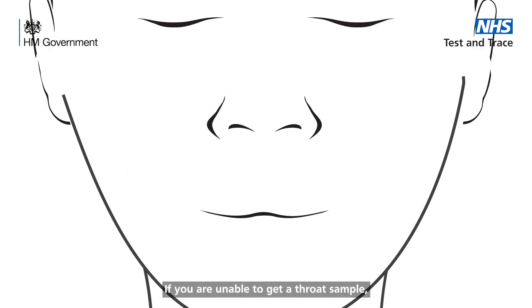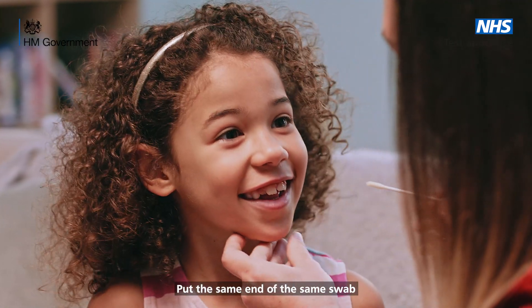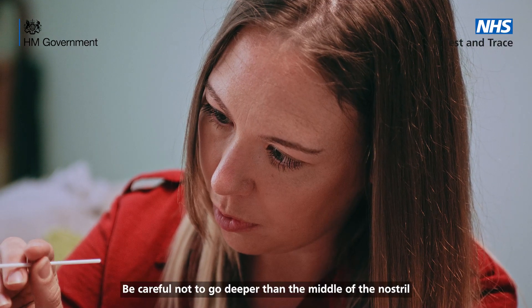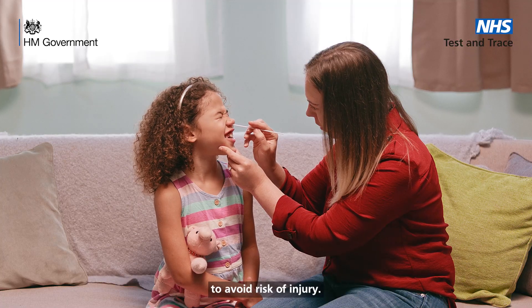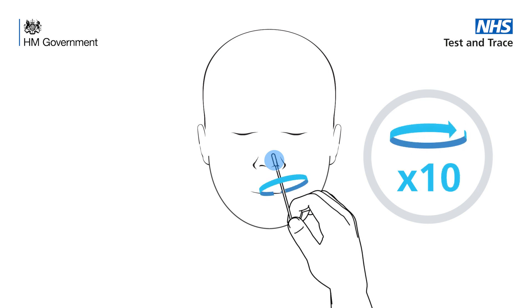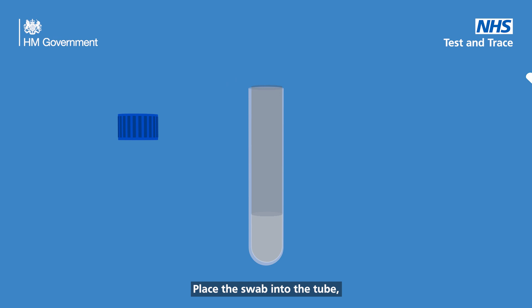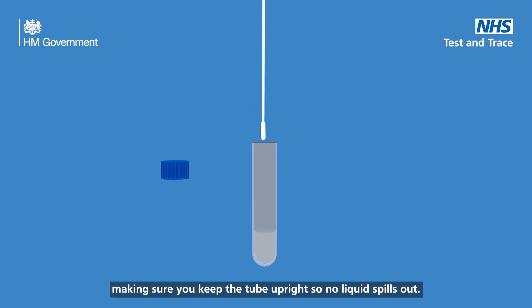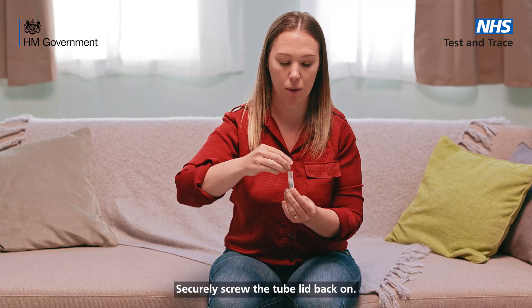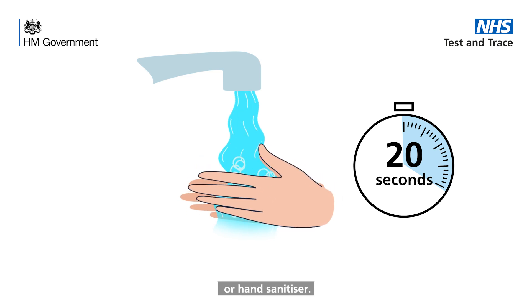If you are unable to get a throat sample, please swab both nostrils instead. The nasal swab: put the same end of the same swab gently into the child's nostril until you begin to feel some resistance. Be careful not to go deeper than the middle of the nostril to avoid risk of injury. Rotate the swab inside the nostril making 10 complete circles, then slowly remove it. Unscrew the lid of the sample tube, place the swab into the tube keeping it upright so no liquid spills out, snap off the other end of the swab, and securely screw the tube lid back on. Now wash your hands again thoroughly using soap and warm water or hand sanitiser.